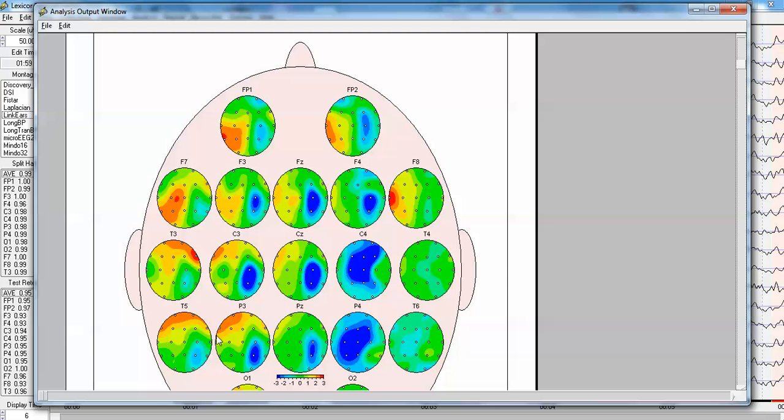And here you can see the right frontal lobe has high connectivity, hyper connectivity, with P3 and T5 and T3. So, T5 has hyper connectivity to the frontal lobe, but this left hemisphere is the healthy part of the patient's brain.